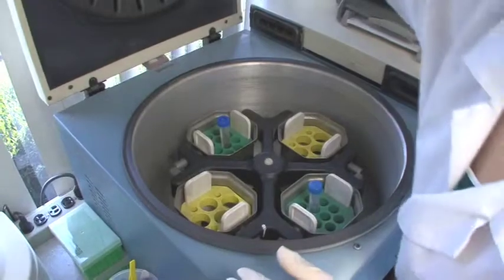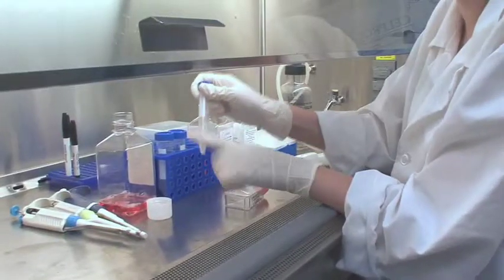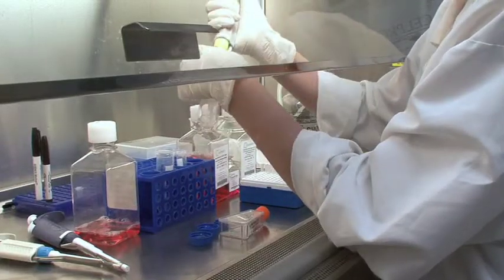Centrifuge at 100 G for 7 minutes to obtain a soft cell pellet. Safely discard the 100% supernatant media. Reconstitute the cell pellet by gently tapping on the conical tube. Transfer the reconstituted cell pellet into a single conical tube.